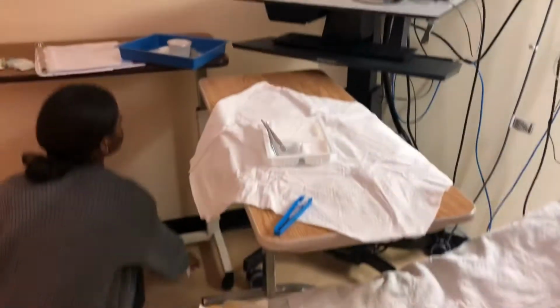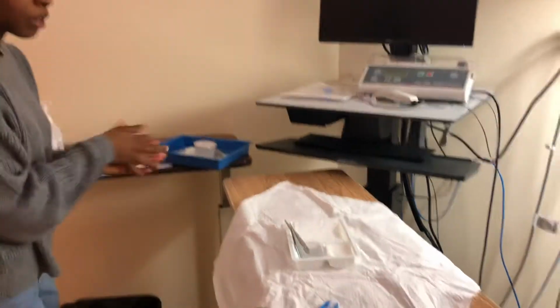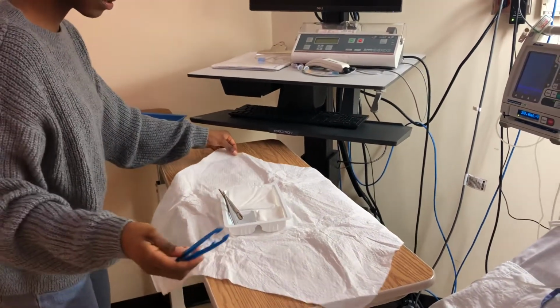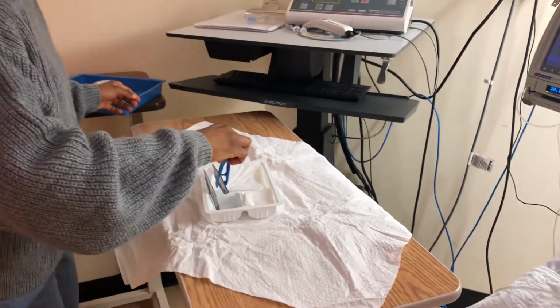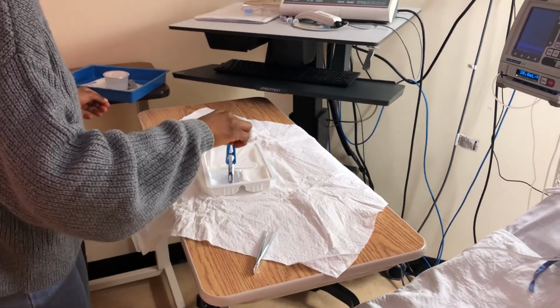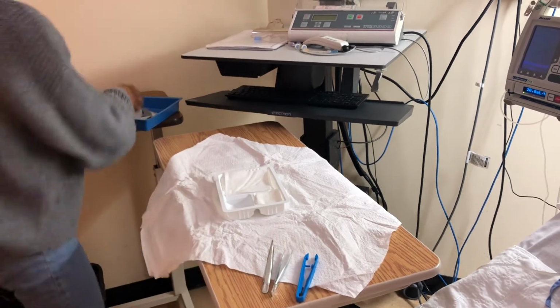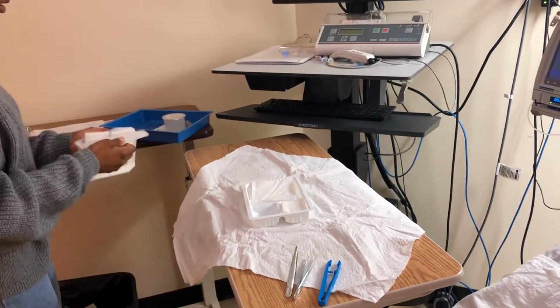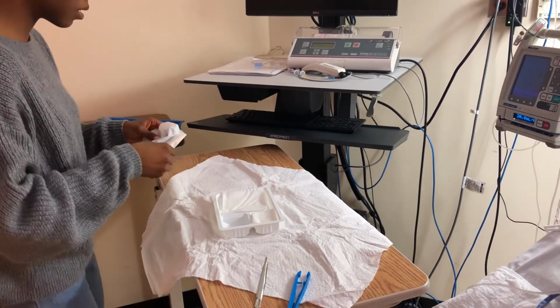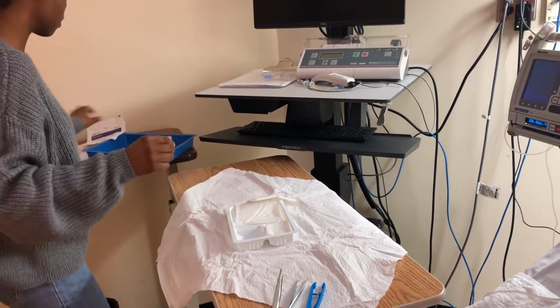Oh, that fell. So I'll do my hand hygiene. And then I'm going to open all my supplies. So just push that here. Open my... ensure to maintain the 1-inch border. Got my ID for dressing.